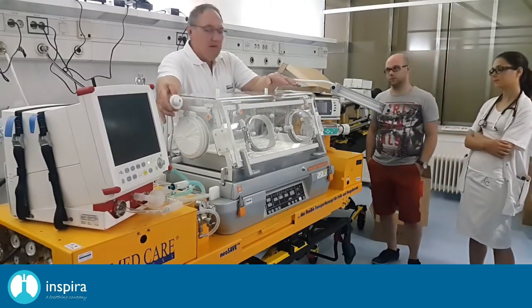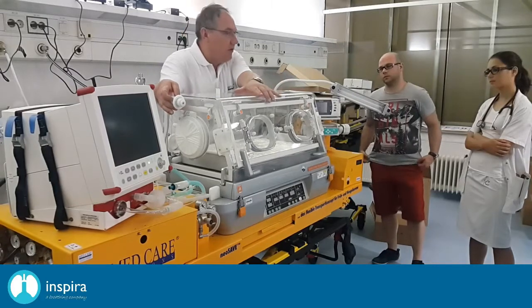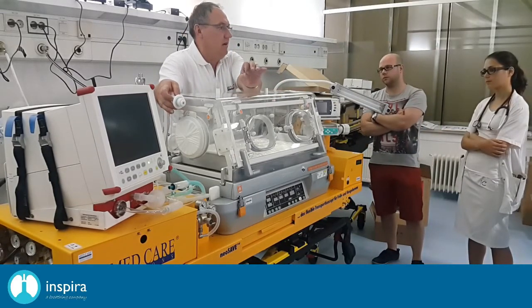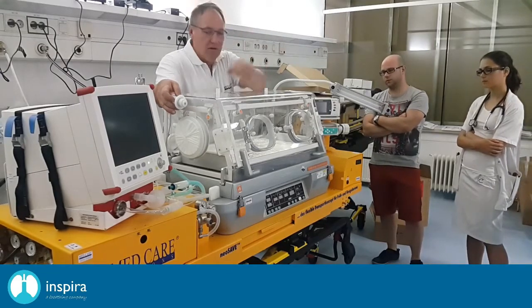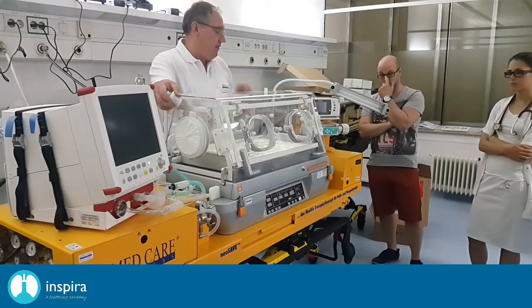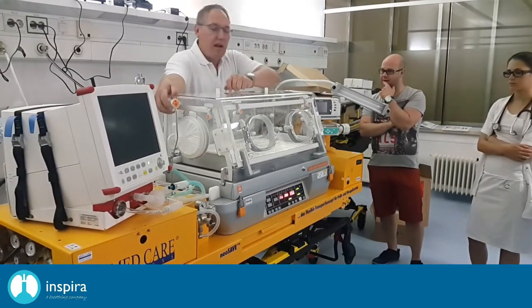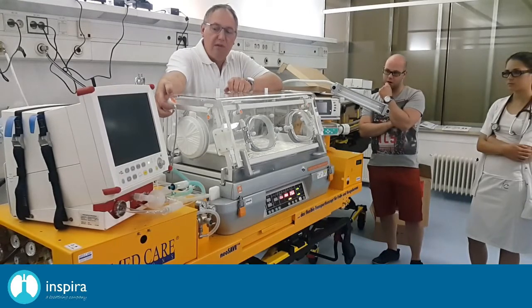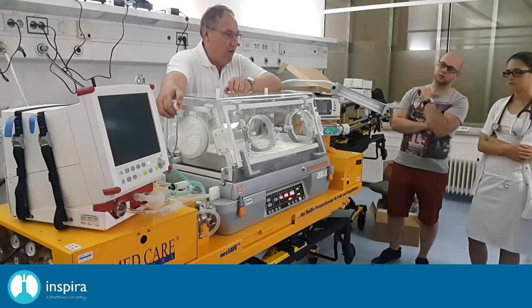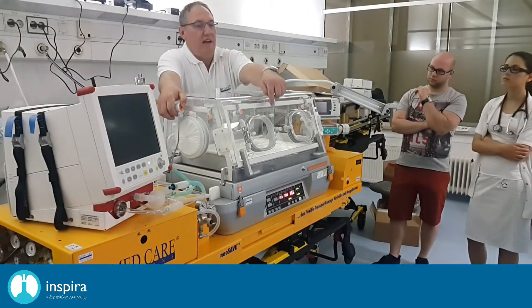In this case, you can measure the oxygen inside the hood, and you also can decide to have alarm borders, on the top level alarm and the low level alarm. In any case, if you are working with oxygen, you have to calibrate the sensor before, and the calibration is done on this transport incubator by pressing this gray knob on the sensor for 30 seconds.